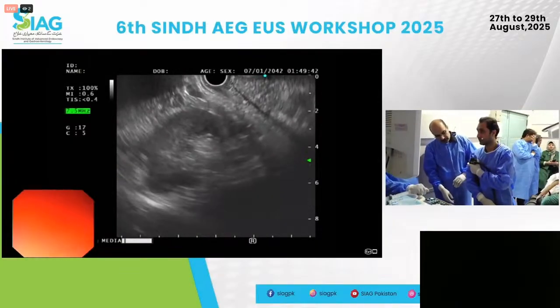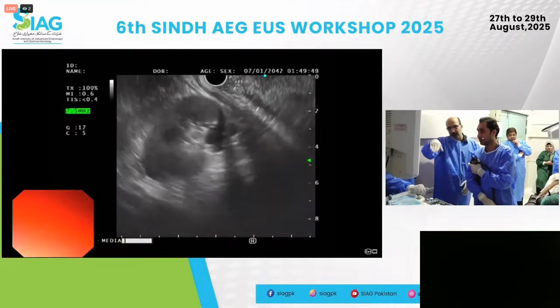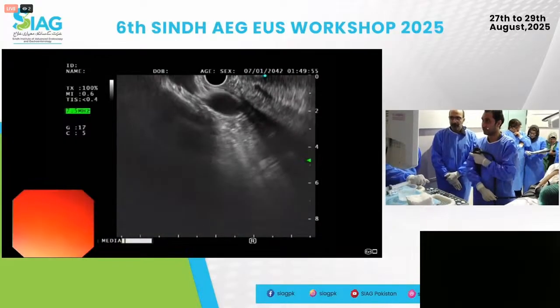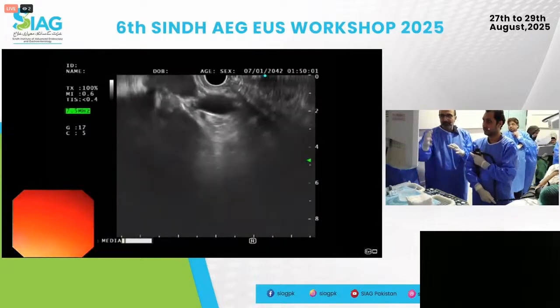Okay, so you're at kidney, right? So now go counter. Keep going counter. The main thing that's happening is you're too stiff. So you're gonna relax and be willing to fall back.